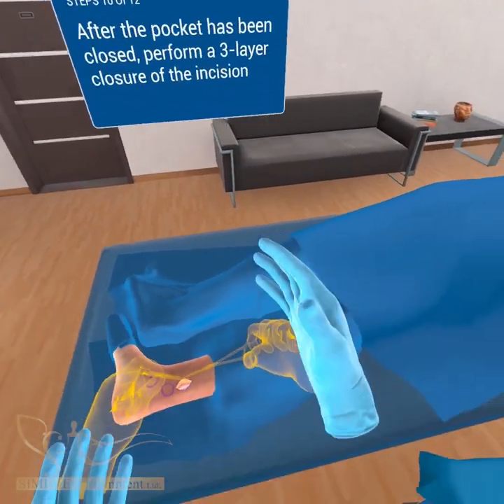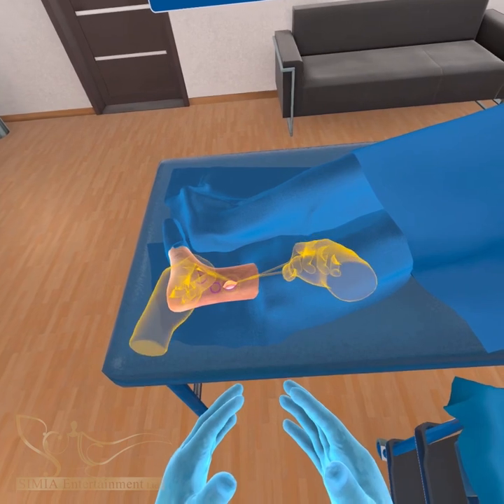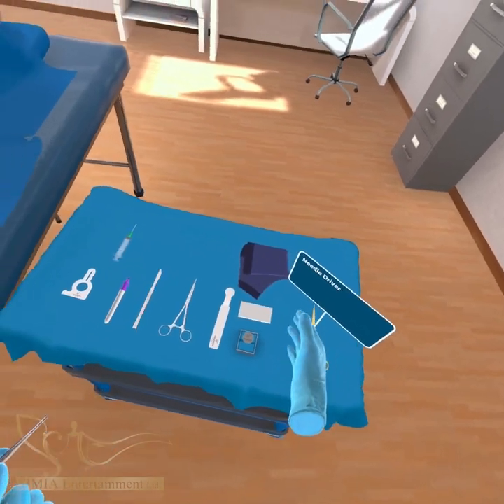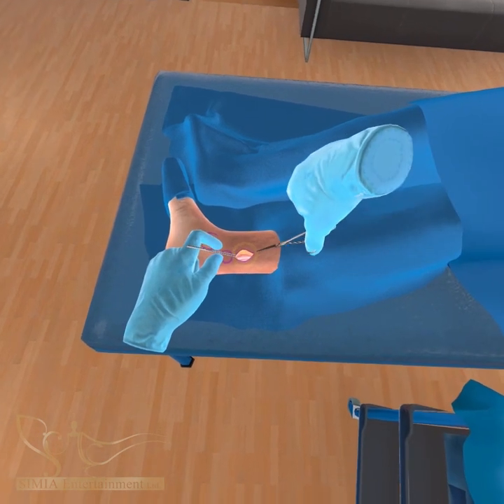Close the pocket by taking a superficial fascial bite near the distal incision and complete the interrupted closure with a deep dermis bite at the base of the incision. Perform a multi-layer plastic closure of the pocket with a three-layer technique.